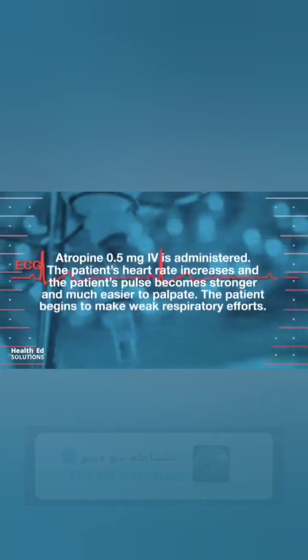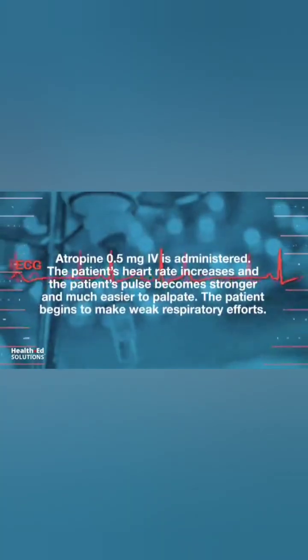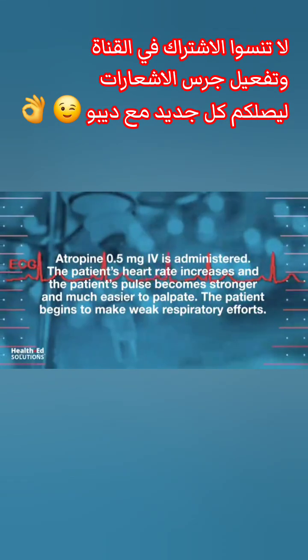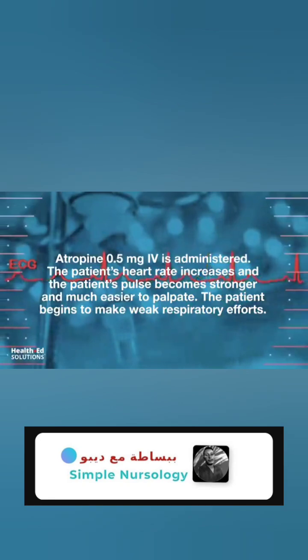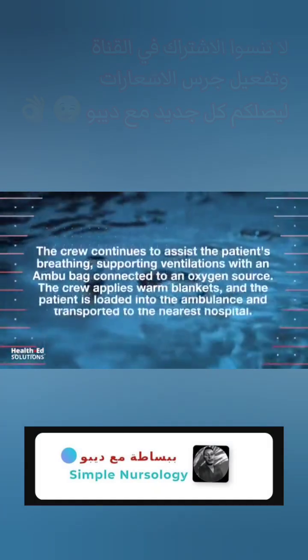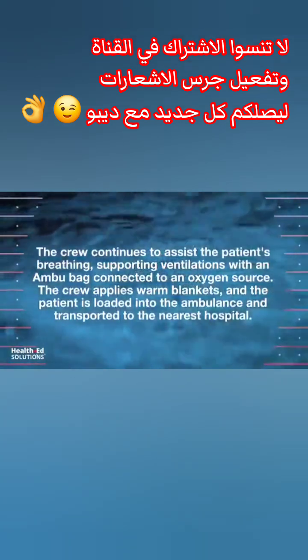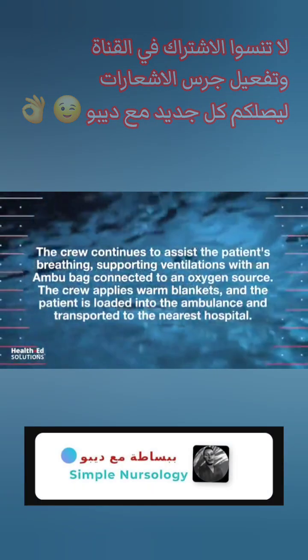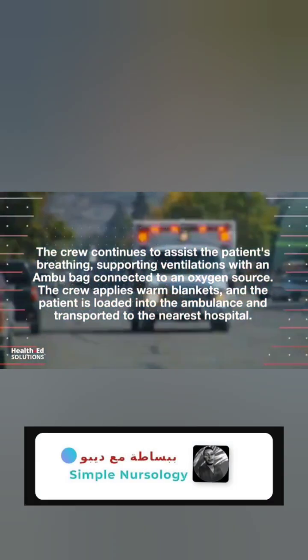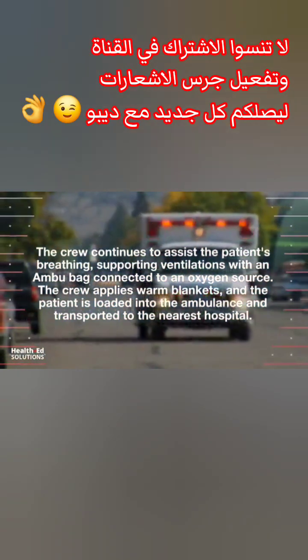Atropine 0.5 milligram IV is administered. The patient's heart rate increases and the patient's pulse becomes stronger and much easier to palpate. The patient begins to make weak respiratory efforts. The crew continues to assist the patient's breathing, supporting ventilations with an ambu bag connected to an oxygen source. The crew applies warm blankets, and the patient is loaded into the ambulance and transported to the nearest hospital.